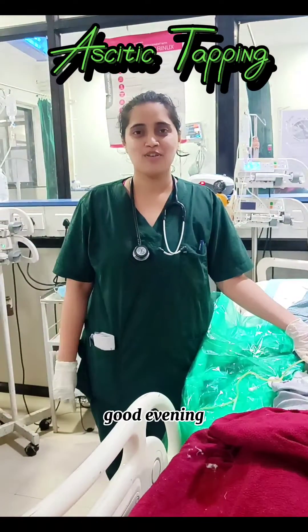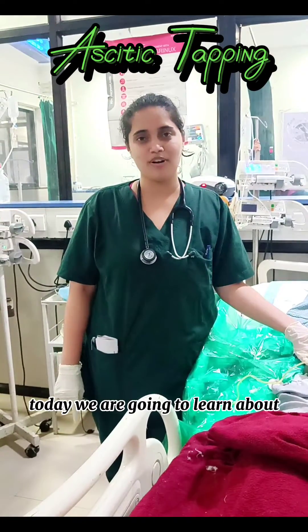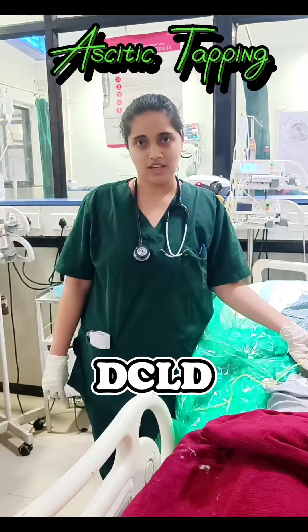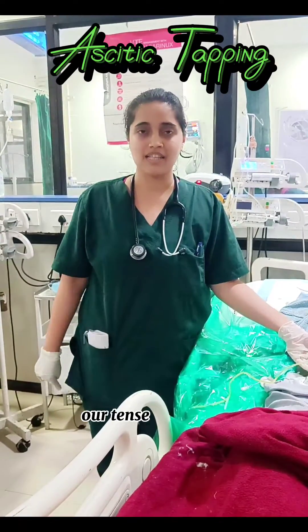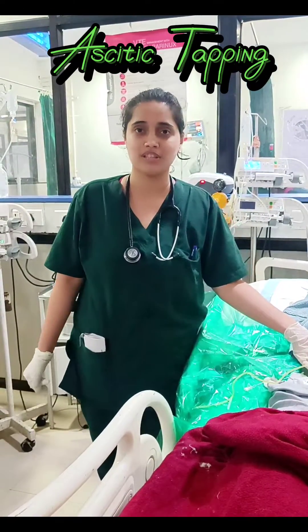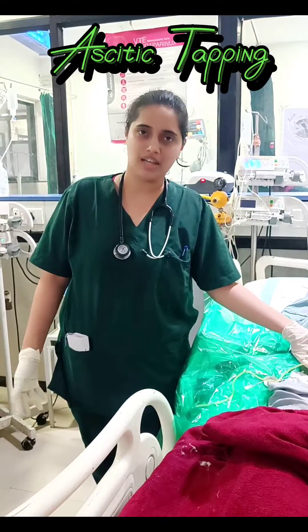Hello everyone, good evening. Today we are going to learn about ascitic tapping. This patient is a case of DCLD with tense abdomen. So we decided to send ascitic fluid to the lab to rule out SBP.